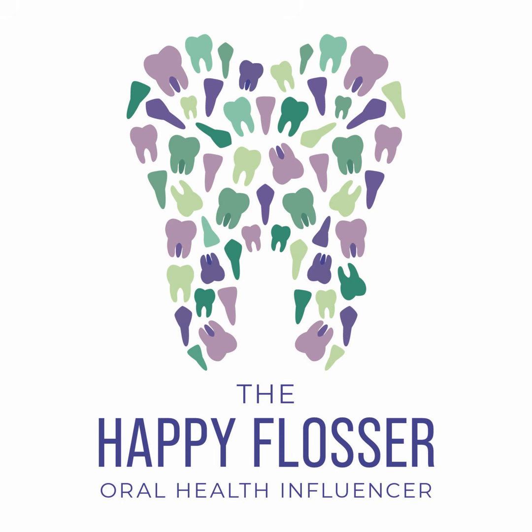So the next more dense item is bone, and you take lots of images of bone. These are the things that we see on our radiographic images. And inside the bone are different items like the pulp and the nerve chamber. You'll see the pulp chamber, the nerve canals, you'll see the periodontal ligament fibers that go around. All of these show up as having a different level of density on those images.